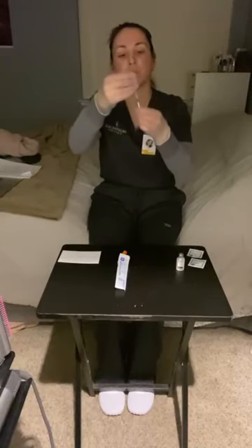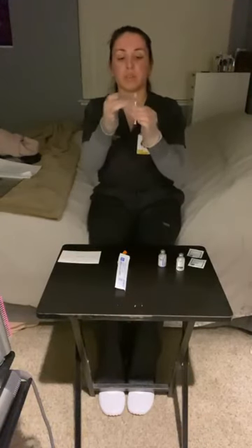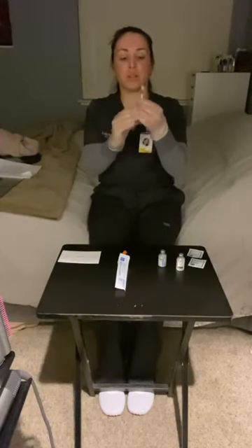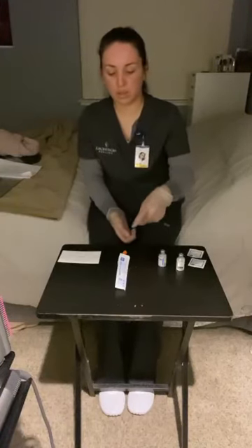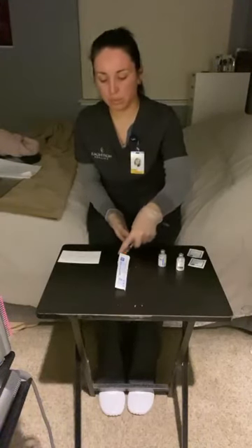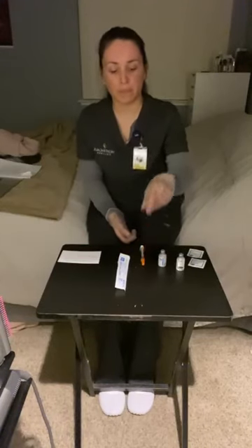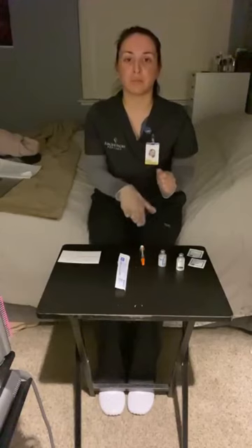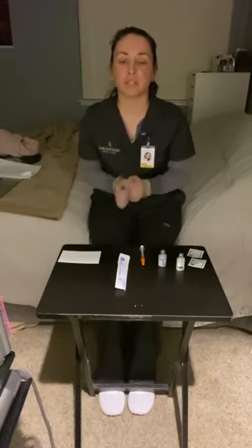I'm going to remove, release any air bubbles, and gently push on the plunger to release any air bubbles. I'm going to keep the needle clean and use the one-hand scoop method. If I was doing this away from the patient's bedside, I would label it with the name and the dose. So now I would remove my gloves, place them in the trash, perform hand hygiene, and document.